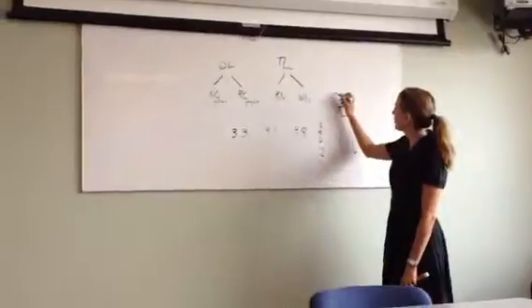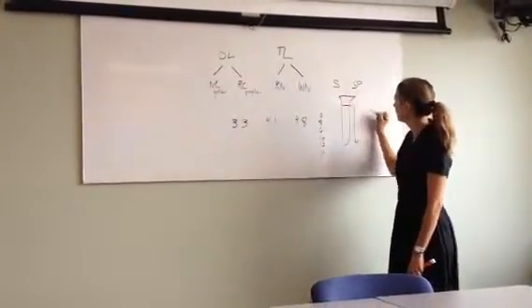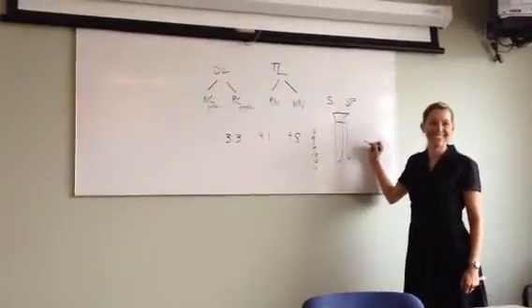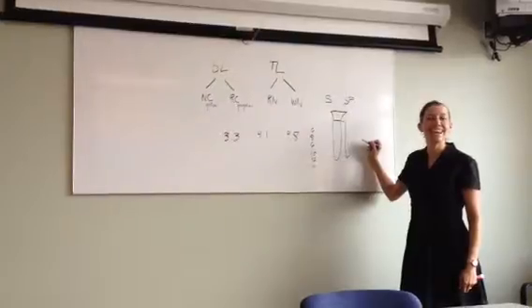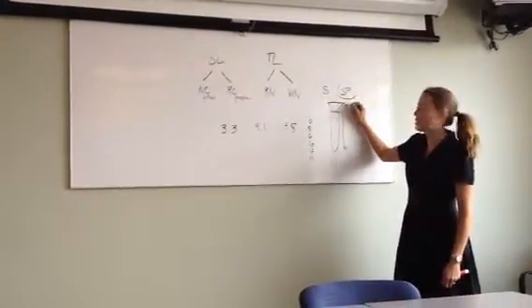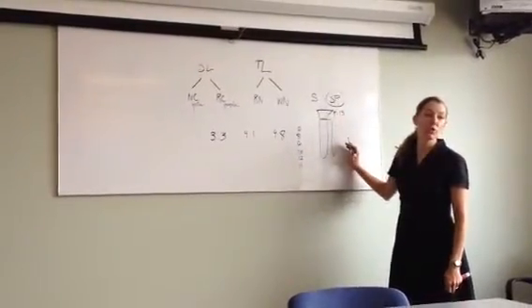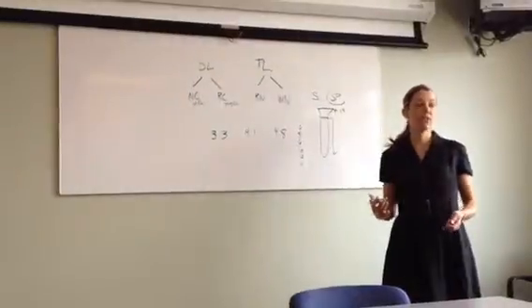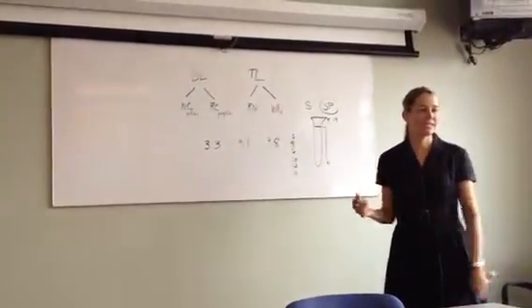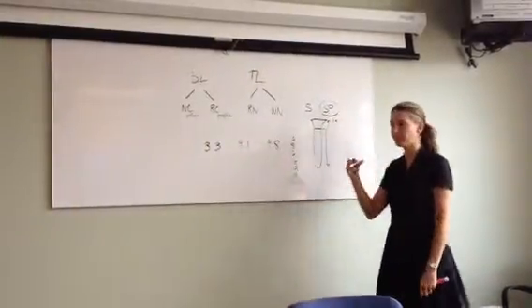Do you remember what the difference is between S and SP? Standard is 2.8, standard plus is 1.8 millimeters. Yes, excellent. So standard plus is the short collar type. It's 1.8 millimeters. If you are ordering an implant, you're almost always ordering a short SP. Remember, it doesn't make any sense. Standard plus you would think would be taller, it's shorter.